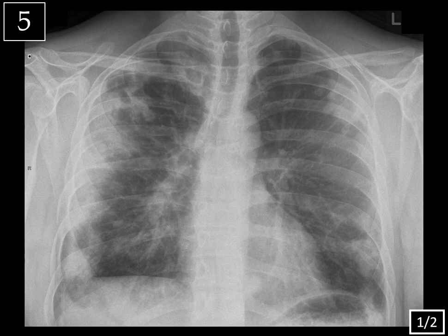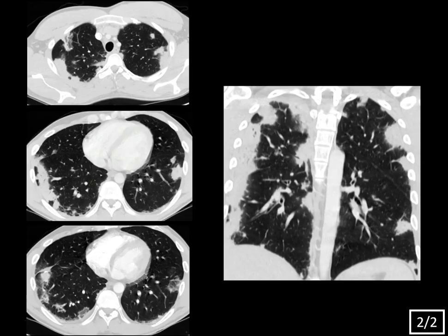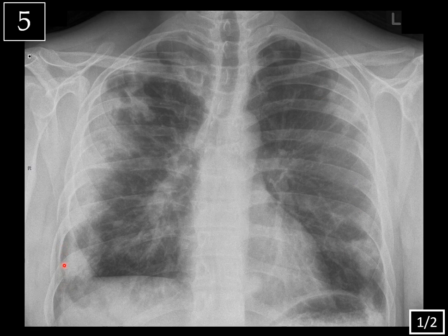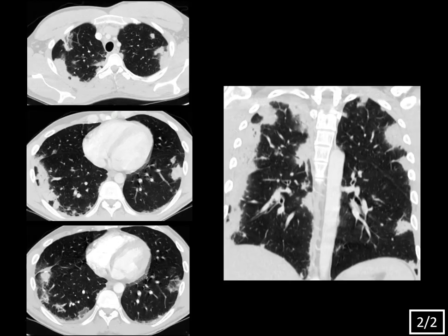Last case — case five, slide one of two. On this frontal view of the chest, there is predominantly peripheral consolidation bilaterally. Also notice subpleural sparing at the right lung base and possibly some lobular sparing at the right lung apex. On the CT scan, you can again see these peripheral consolidations, and note the subpleural sparing in certain areas.